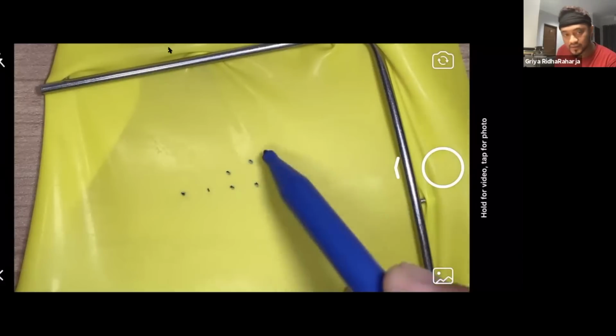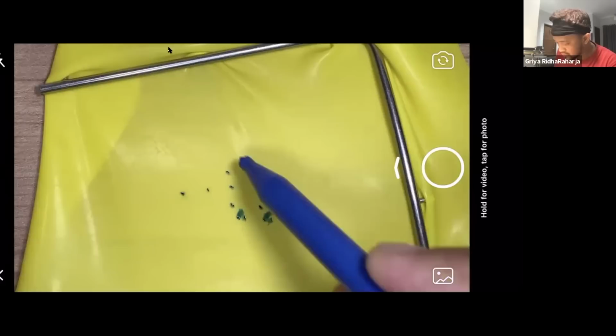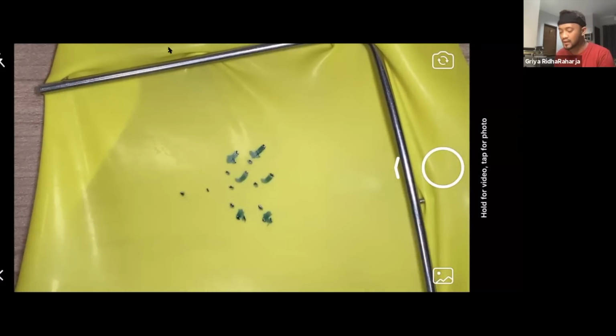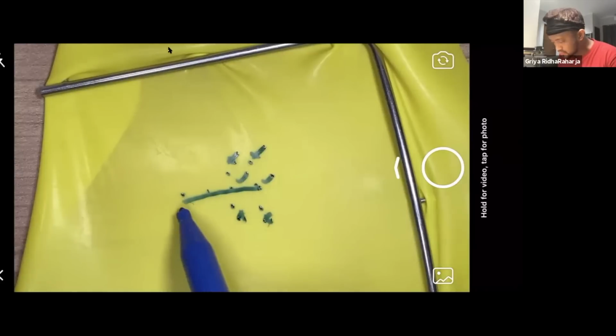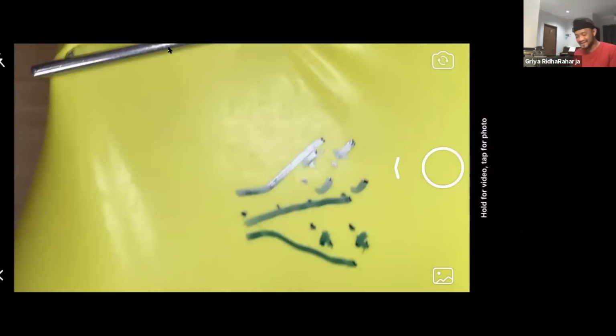It's wrong if you put it in here or in here. There is no line. Or like this, this is wrong. So this is correct. They must be straight like this. This is wrong. I will replace it, this is dirty. So sorry. Ah, I have another one, because I'm so excited to explain to you guys.